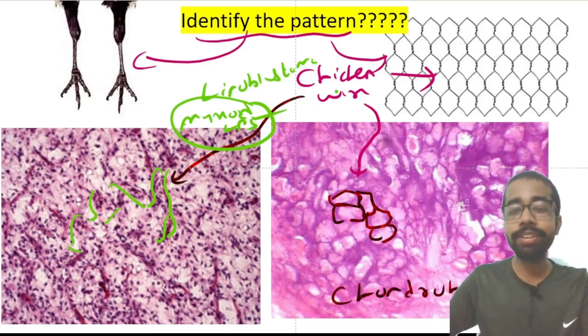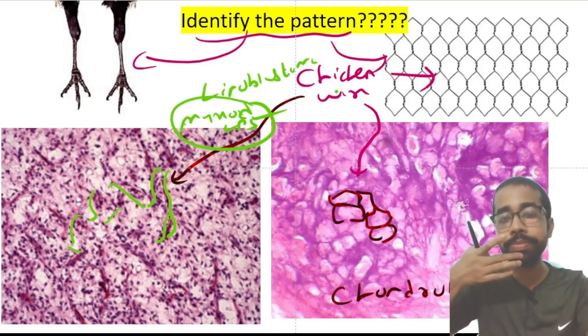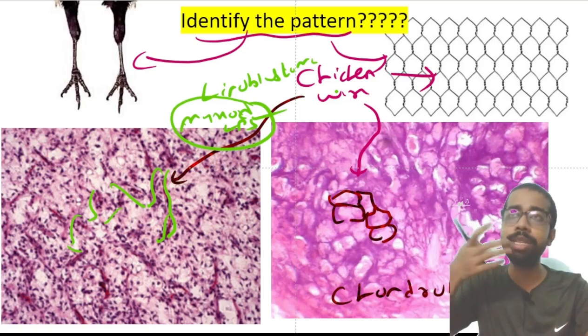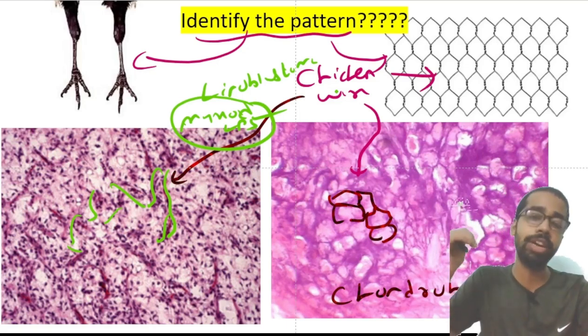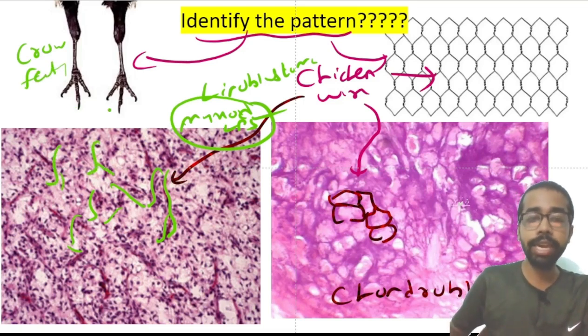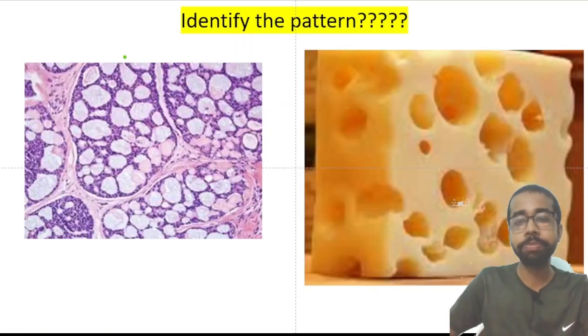Okay, I don't want to prolong the video, but still, myxoid liposarcoma is associated with which mutation? EWSR1, DDIT3. Hope you remember that. And any other question like myxoid liposarcoma, they can ask MDM2. Is it positive? Right? Negative. MDM2 is negative in myxoid liposarcoma. Cool. Okay. And this one, what is this thing? This is nothing but crowfoot. Even the vessels, many told it can be crowfoot-like vessels. Okay, anything is okay. Either chicken wire or crowfoot, whichever god you are fond of, you can name accordingly.